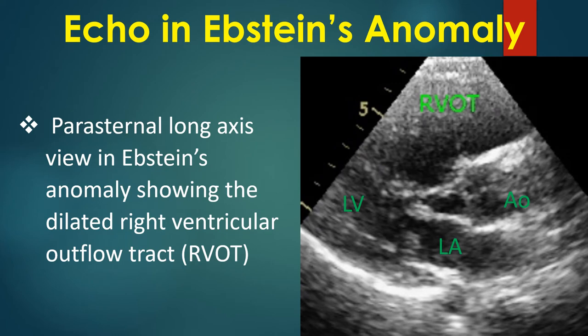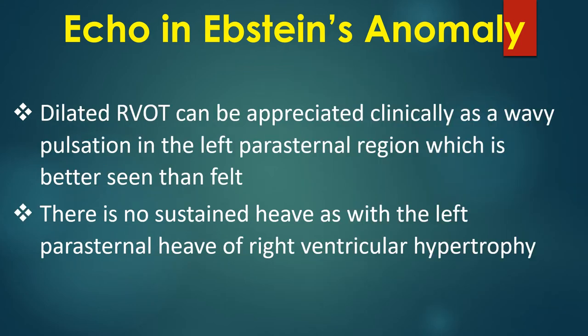Parasternal long axis view in Epstein's anomaly showing the dilated right ventricular outflow tract. Dilated RVOT can be appreciated clinically as a wavy pulsation in the left parasternal region, which is better seen than felt. There is no sustained heave, as would be seen with the left parasternal heave of right ventricular hypertrophy.